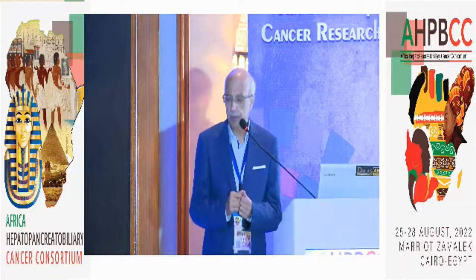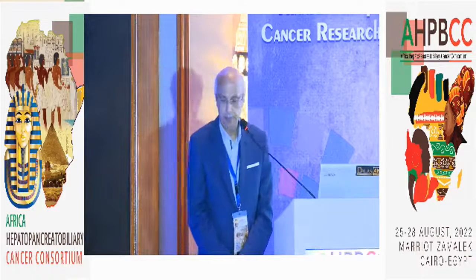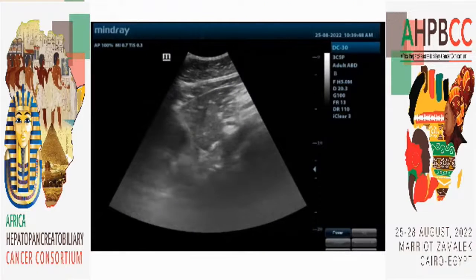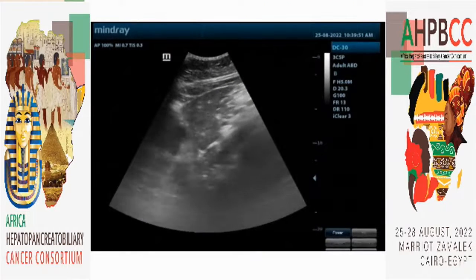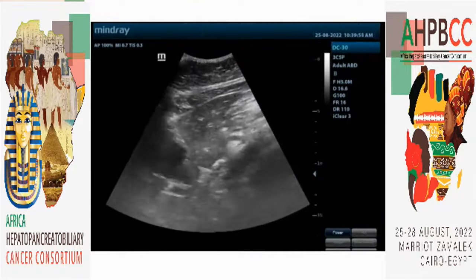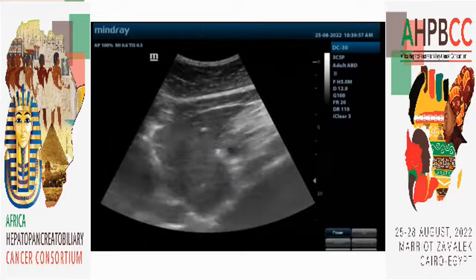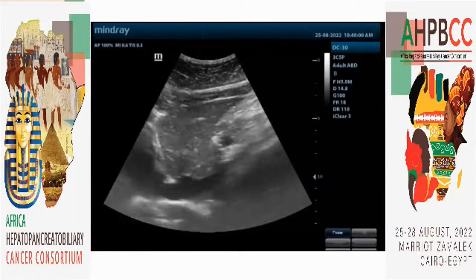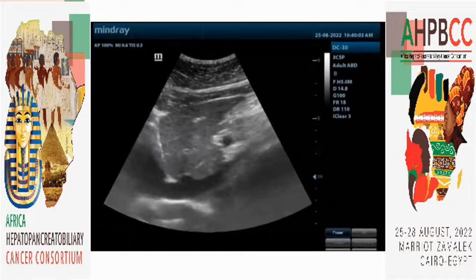Evaluation, the vasculature. Longitudinal section, left lobe. Again, this is the left lobe, the surface. Here we can see the left lobe, ligamentum venosum, which is the echogenic line.